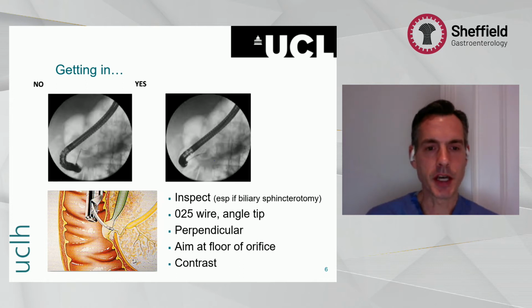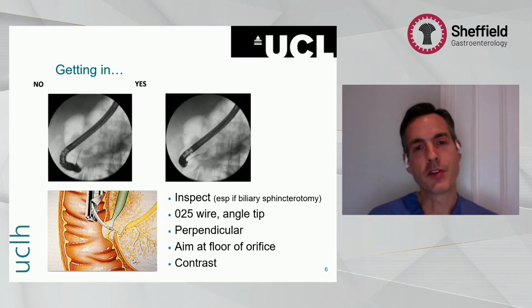Are you seeing my pointer here? You want to have a perpendicular approach, as shown here on the right, to try and aim perpendicularly. The pancreatic duct runs away at sort of 90 degrees from the duodenal wall. Before you do anything, have a real close inspection of the orifice.